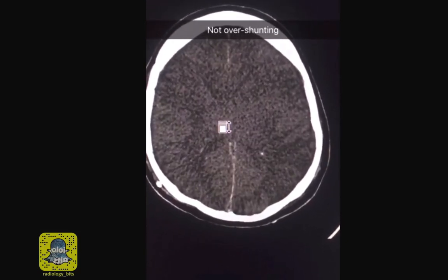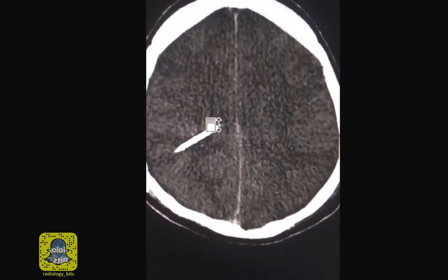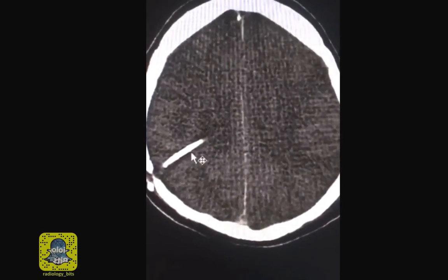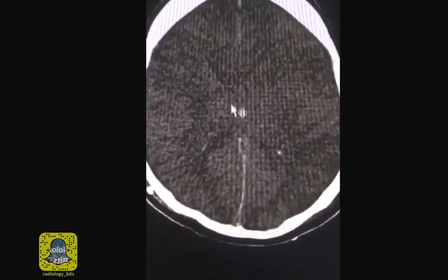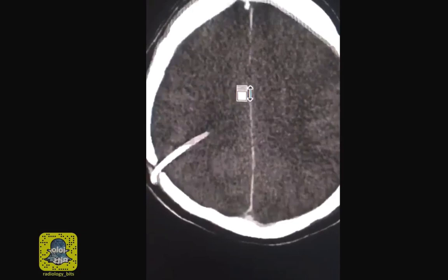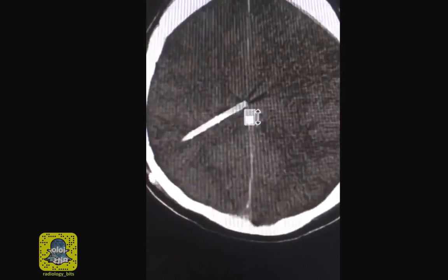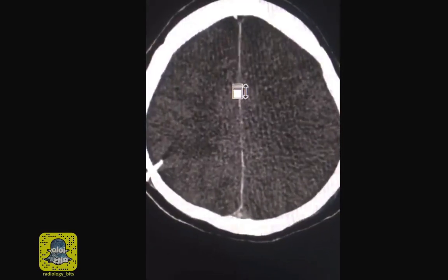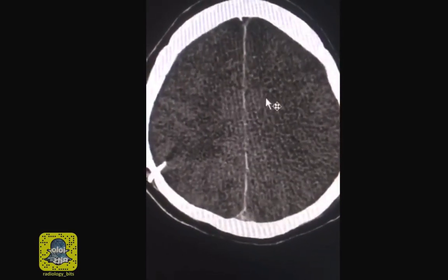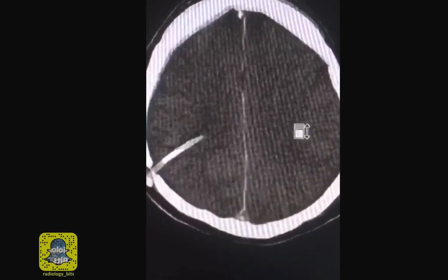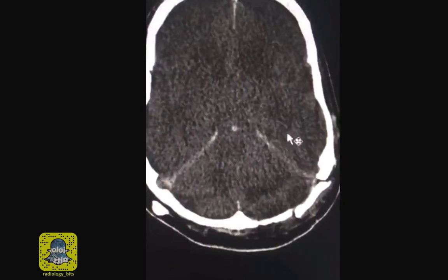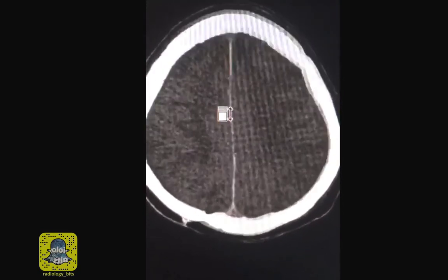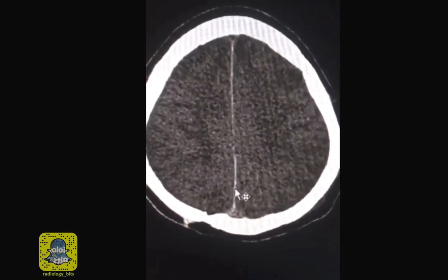This is not the case here for a few reasons. Over-shunting means that we are over-draining the CSF from the ventricles, which could lead to a small slit-like or even totally collapsed ventricular system. In that case you would not expect to have effacement of the other CSF spaces. To the contrary, you'd expect with over-drainage that the CSF spaces at the convexities would be more pronounced.